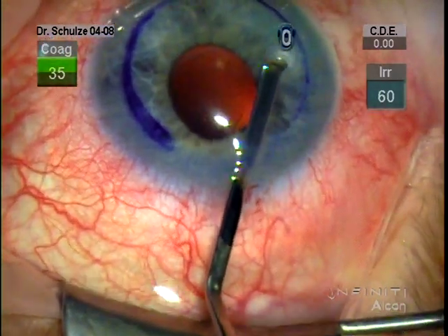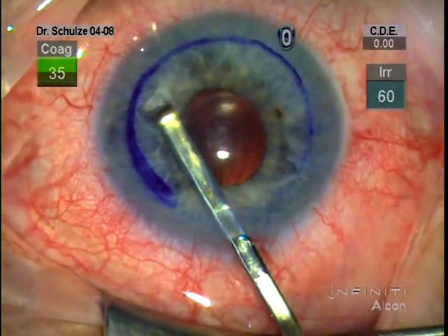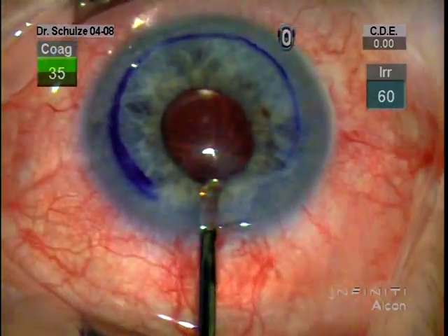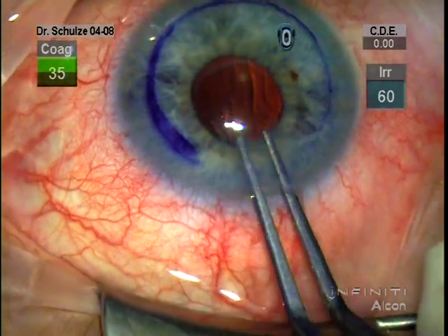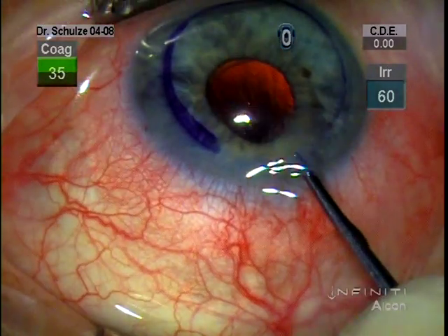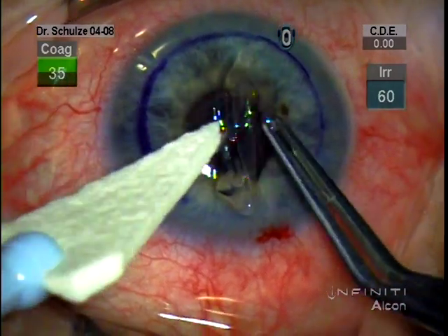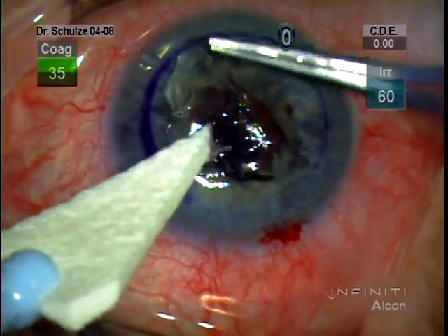You can see Descemet's starting to peel back here on the monitor. It's coming off fairly nicely and it looks like it's almost freed up. Sometimes the whole thing will come out with the scraper, although in this case I just reached in with Kelman McPherson forceps to pull out the Descemet's. Typically once it comes out, it's somewhat folded up and the edges are torn. But I often like to just unfold it over the cornea to see if there are any button holes or patches that I've left behind.